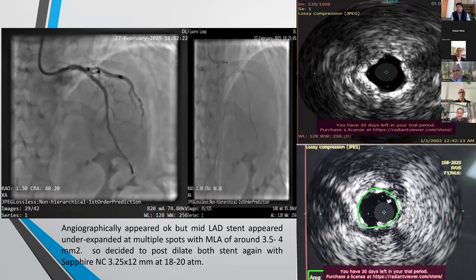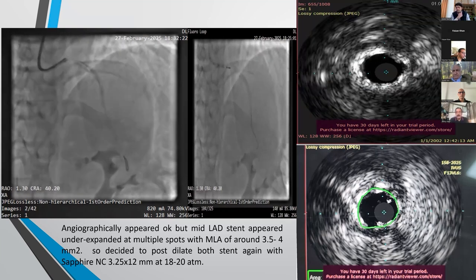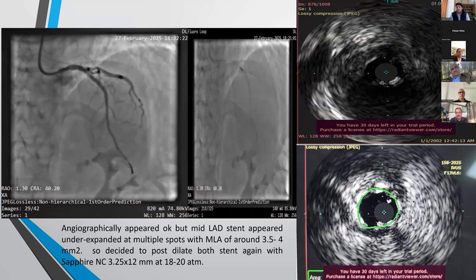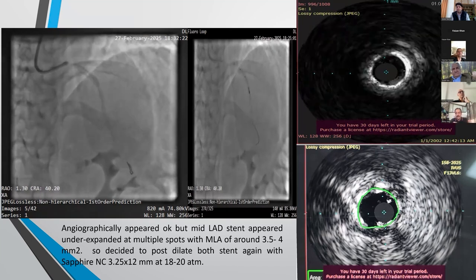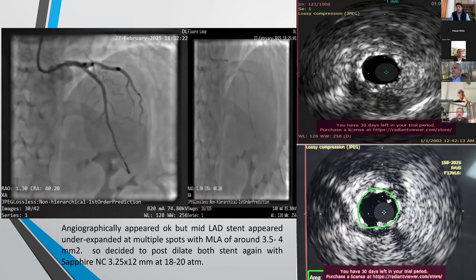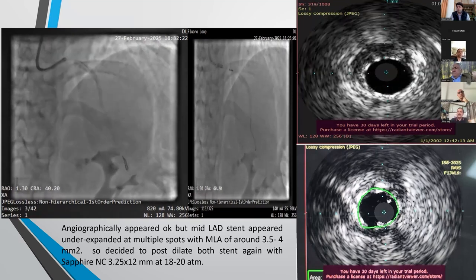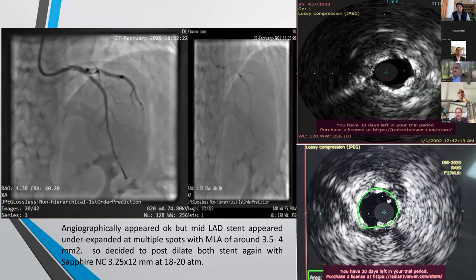So yes, Bashir sir. As I told you, we have been using FFR, IFR for a while now, 3 to 4 times easily without any problems. Whenever we don't like the waveform, or we think looking at it that it's bad, we stop. Initially we compared new and reused wires. When we started, we used the new one and also tried to reuse one and see if they are comparable or not. And we did not have any problem with any of them.